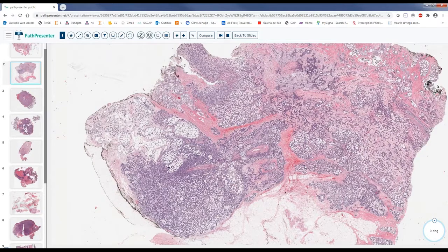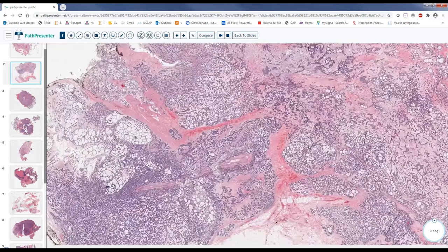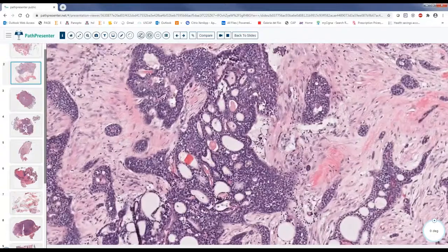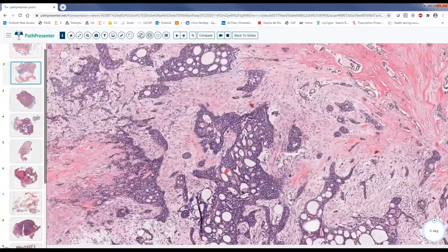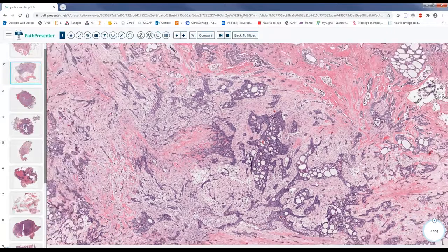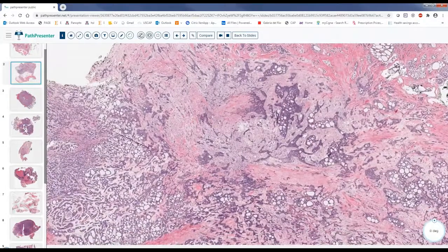Basically, you have to tell them either low grade or high grade. Okay, and the most important component to give them this is the amount of solid areas. Maybe you'll find some areas kind of solid like this. Overall, if it's less than 30%, that's fine. You're still at the low grade. Okay.